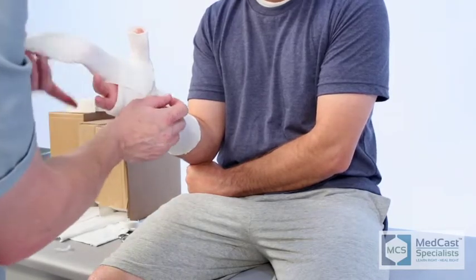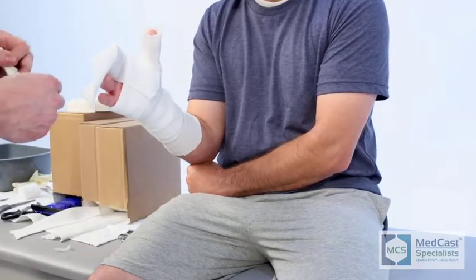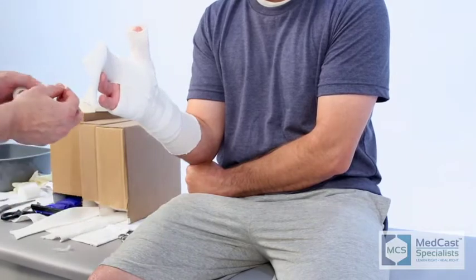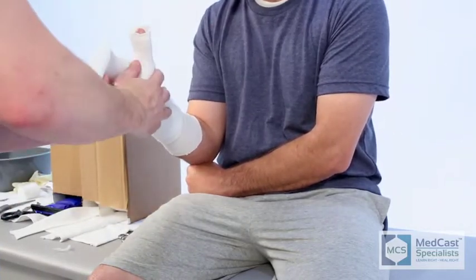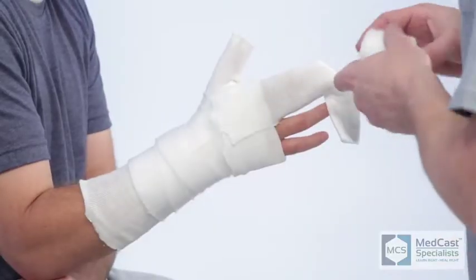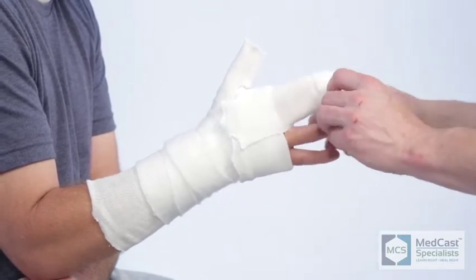On a cast, typically they're going to be in it for 2 weeks or longer, so it's good practice to put padding between the digits. It helps with the maceration and reduces some of the odor. Anytime you incorporate toes or fingers in the cast, it's always good to use some type of gauze or something to absorb the moisture that's created.